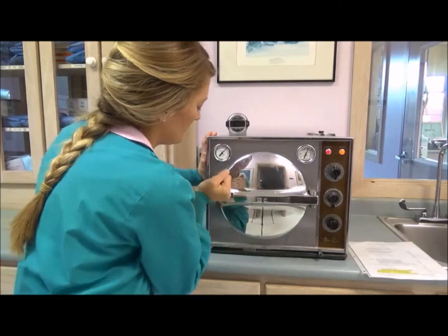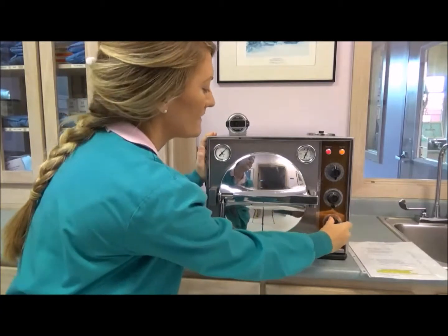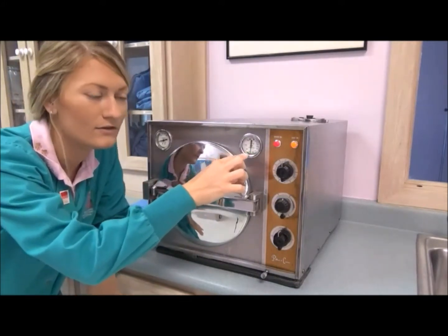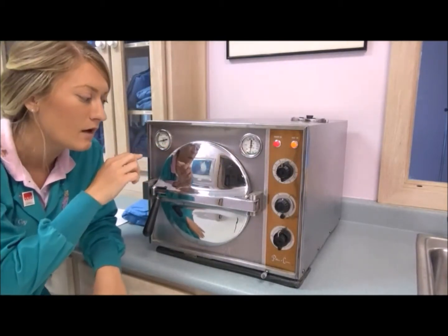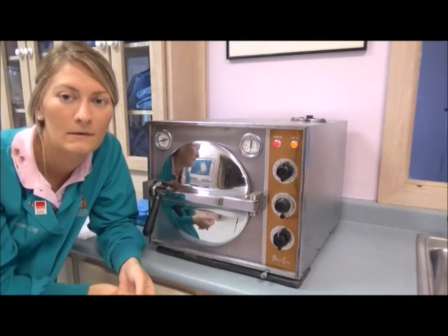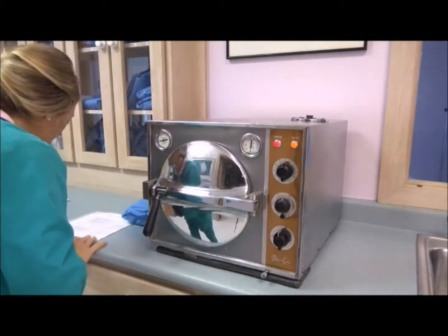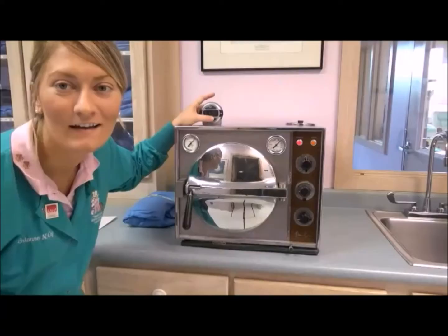Okay, that's good. I'll shut that. So now I'm good to set the machine to sterilize, and we'll come back to things. The proper temperature the autoclave should reach should be between 250 and 270 degrees Fahrenheit, with PSI measuring between 15 to 27. On average, it takes about 15 minutes for an autoclave to reach these proper numbers. Our machine, however, takes about 30 minutes. And we're good to go to the next cycle now. So follow my sheet. Okay, we'll come back to things.